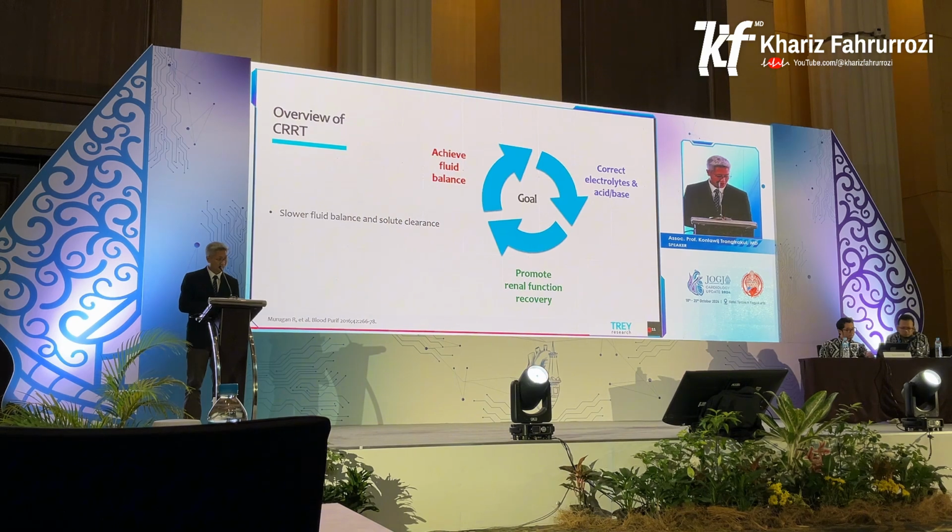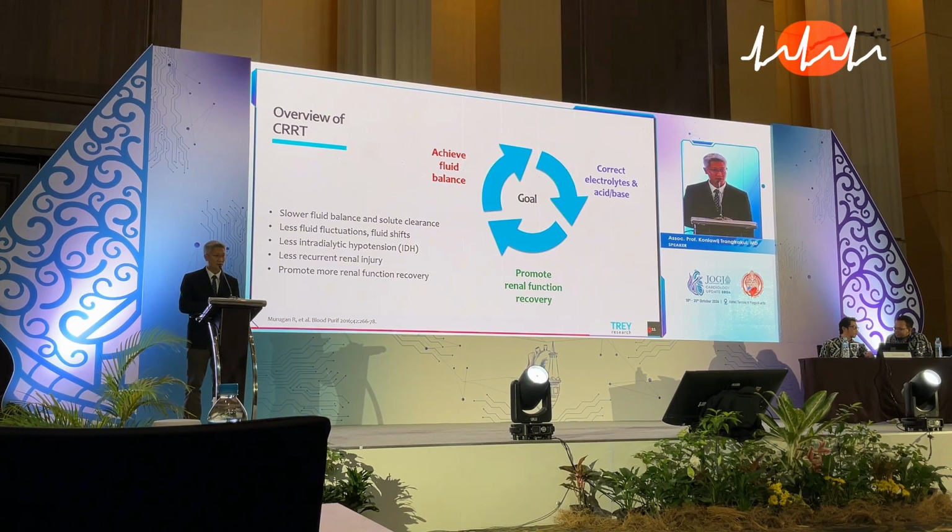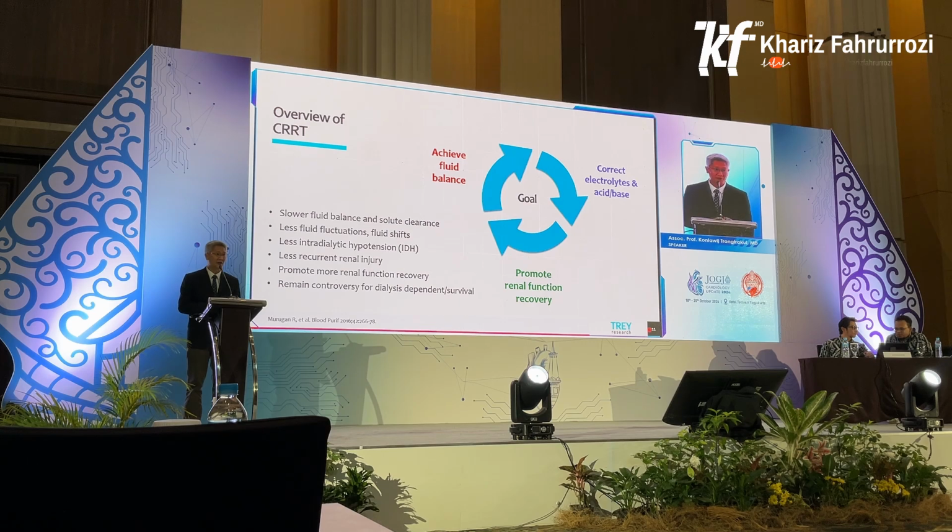Because it is more hemodynamically friendly, with slower fluid removal than intermittent hemodialysis. There is less fluid fluctuation and fluid shift, less intradialytic hypotension, and it is supposed to cause less renal injury and may promote renal function recovery better than intermittent hemodialysis. However, in terms of survival, it's still controversial.